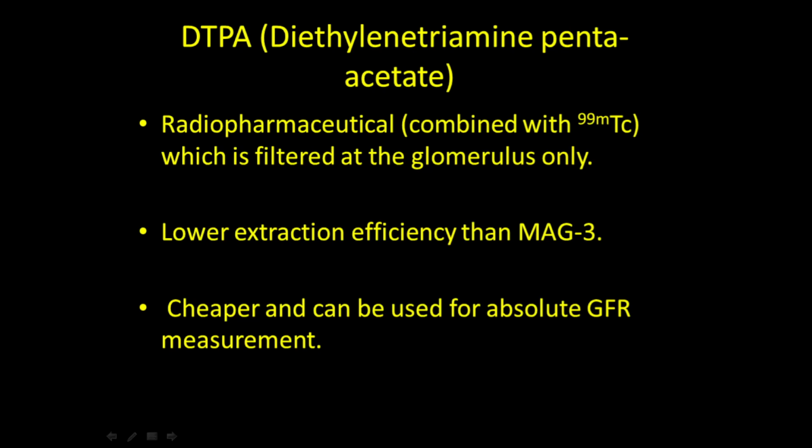Hello and welcome to part 2 of this series on nuclear medicine of the urinary tract. In the last part we had a rather long discussion on how MAG3 perfusion scintigraphy of the kidneys is performed, what sort of images we look at, and what its purpose is, namely to examine the physiology of the patient's kidney in order to determine if there is obstruction present or not.